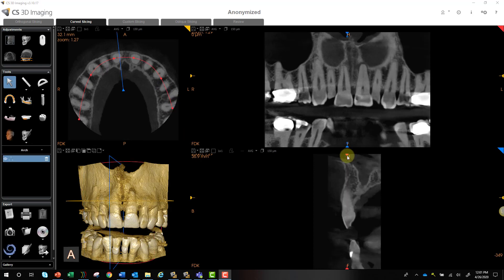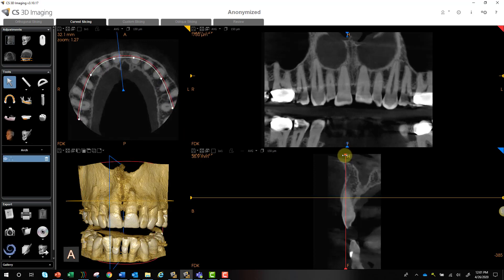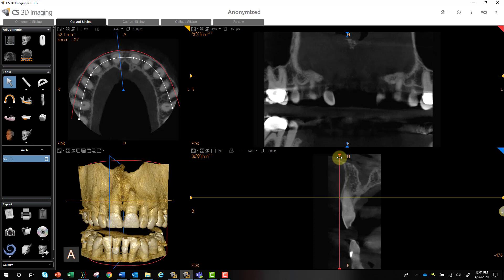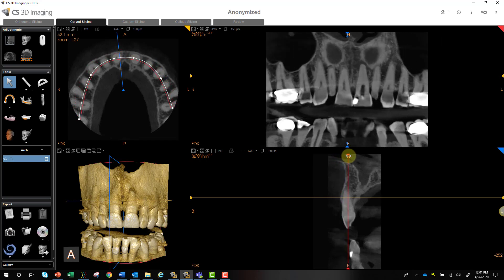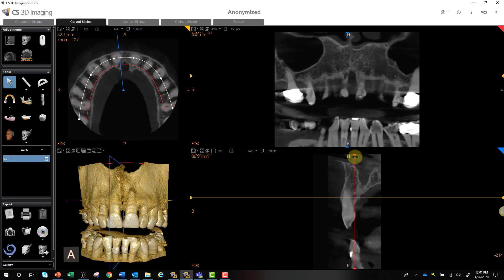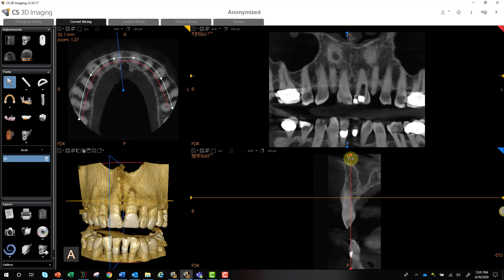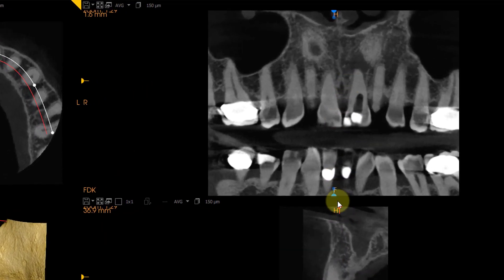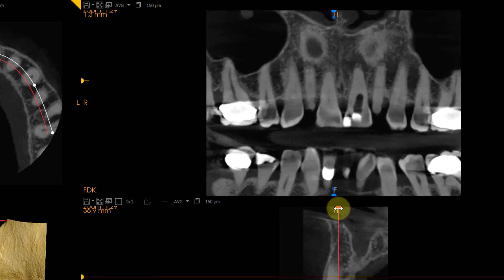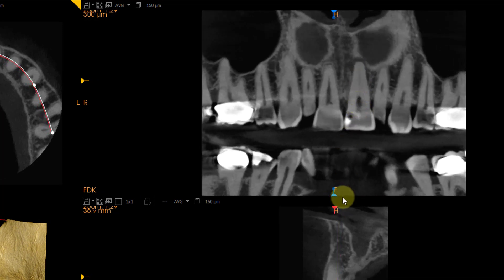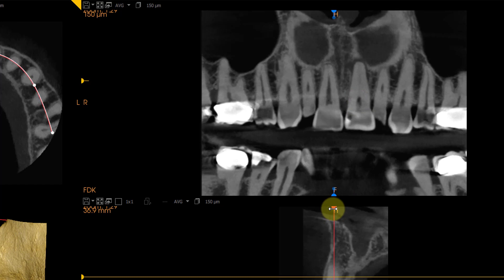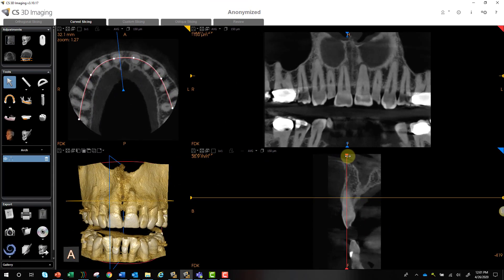This is a nice overall perspective where I can move my slice all the way out to the facial — you can see my red line over here, showing where I am. I'm just slicing to the palate, getting an overall perspective of what's happening. We can see the axis on number 9. Continuing out to the facial, we can see the actual canal, which gives me a little bit of an overall perspective of what's happening.